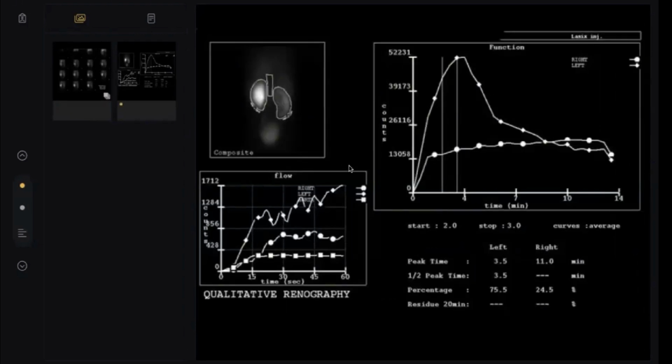How to differentiate between both types of obstruction? How many types of obstruction do you know? Obstruction could be due to baggy pelvis or due to PUJ obstruction. Okay, but we have two big titles: mechanical obstruction and non-mechanical or pseudo obstruction.